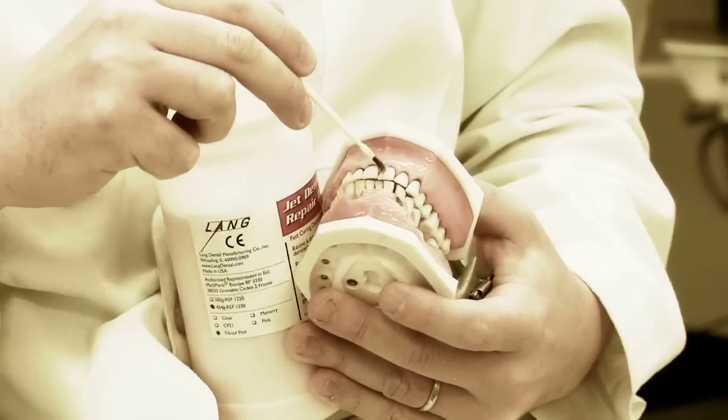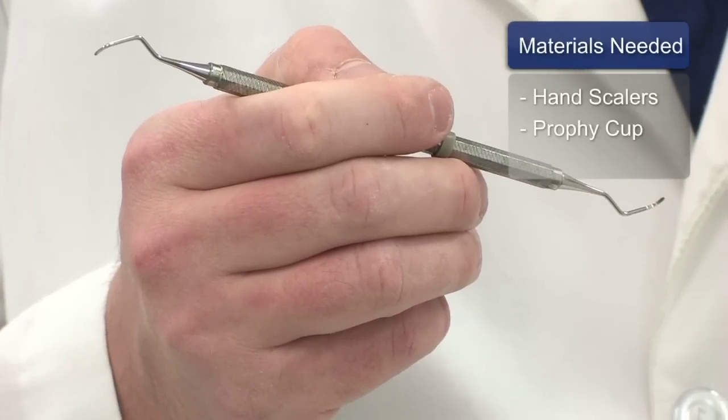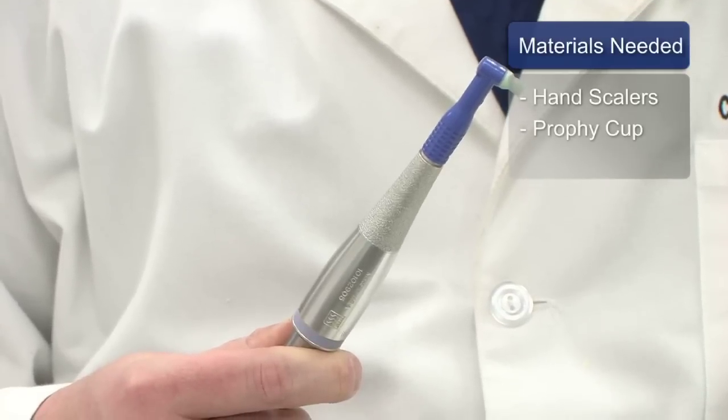Hi, I'm Dr. Mike Glassmeyer from First Impressions Family Dentistry in Antioch, Tennessee. We're going to be discussing how to remove calculus and calcium stains from teeth. The two most common materials used to help remove those calcium deposits from teeth involve a set of instruments called hand scalers, typically used by a hygienist, and what's called a profi cup or profi angle to further polish.